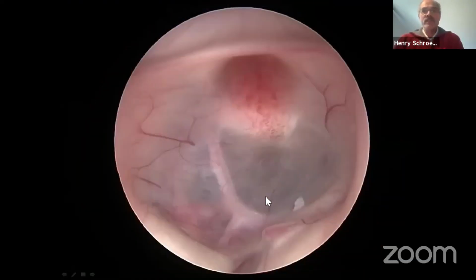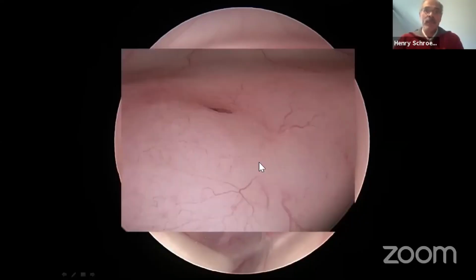It's another patient. This is an ideal floor, very translucent. You see here, this is a clivus. This is the infundibular recess. This is a chiasm. Mammillary bodies, and what is that? That is a PCOM running very far medially. And here you see the oculomotor nerve shining through the floor. So this is an ideal case, and of course the best location for an ETV would be that space.